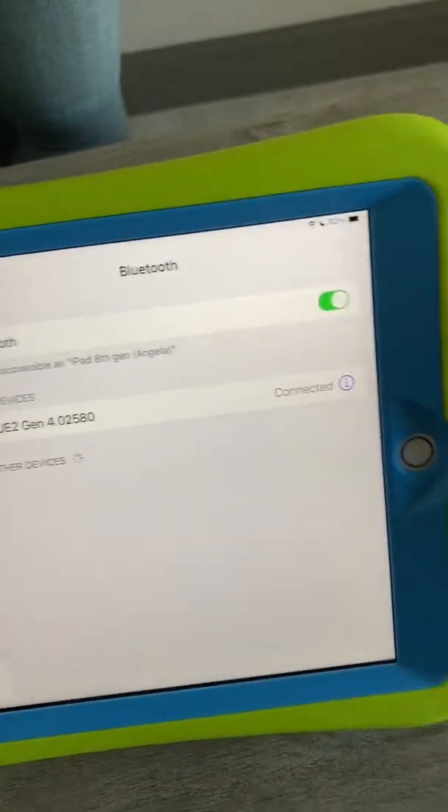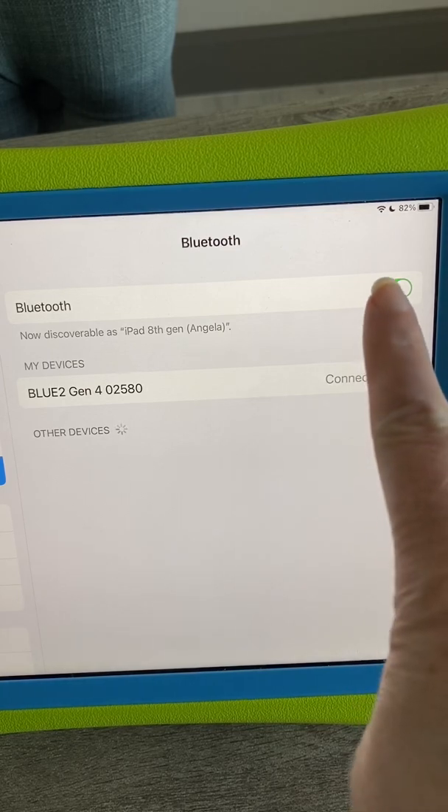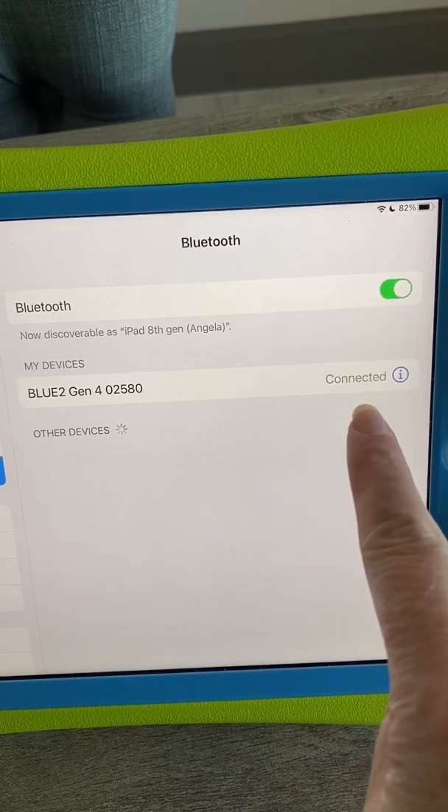Because I'd already paired this before, it automatically connected. If you haven't done that, you need to go through the process of pairing it. But I can see I have Bluetooth on and it's connected.